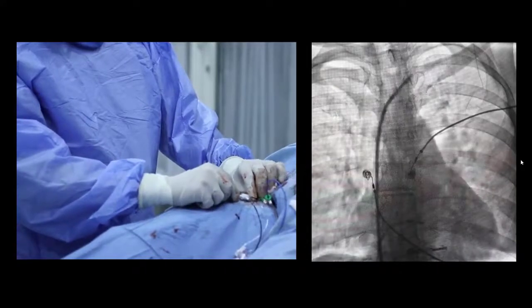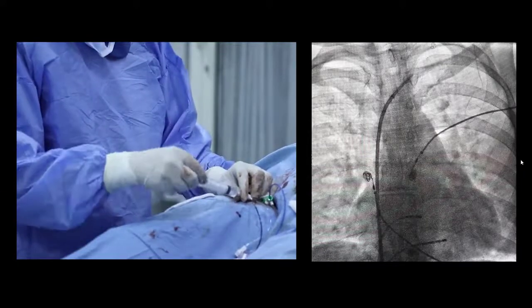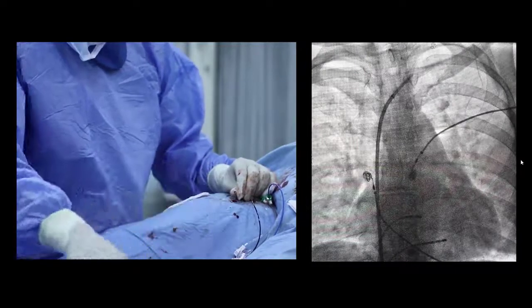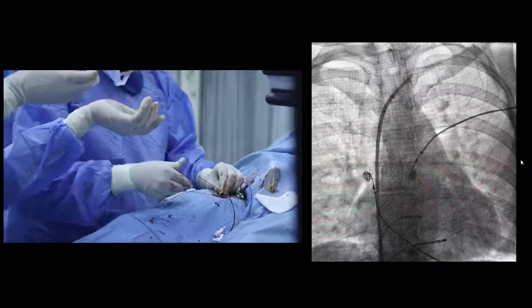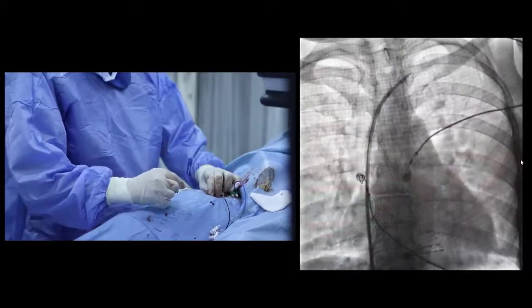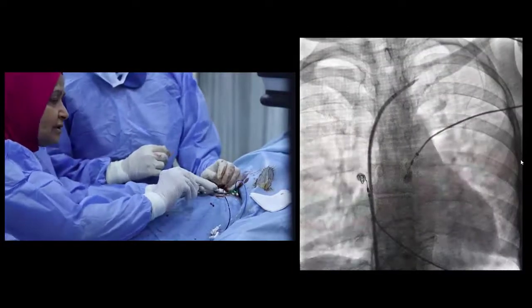Then we will withdraw the wire and start to insert our transseptal needle via the long sheath. Then we adjust the transseptal needle. We can see here the needle is inserted. We were adjusting the curve so that it can hinge over the fossa ovalis of the interatrial septum.